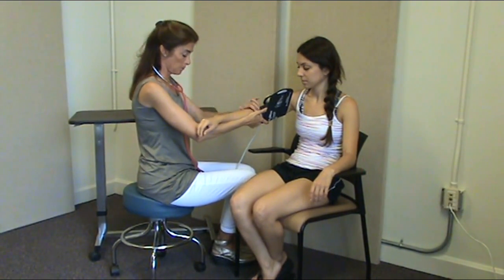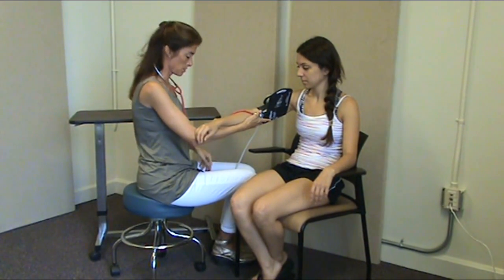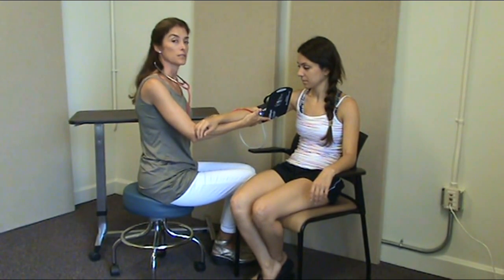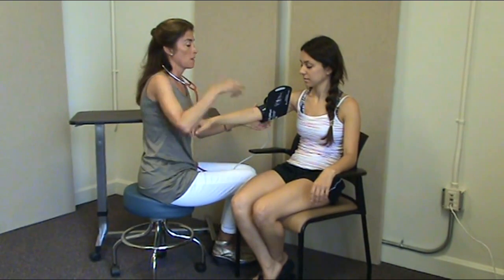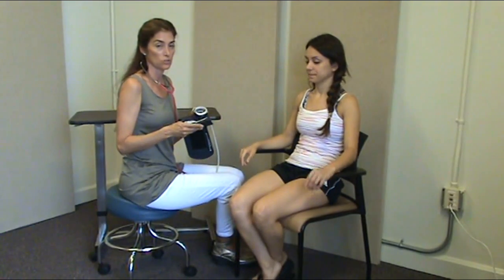Then you'll place the diaphragm of the stethoscope on top of the brachial artery, inflate the blood pressure cuff, and slowly deflate. Make sure you deflate the cuff completely before you remove the cuff. And don't leave a cuff half inflated on the patient's arm. It's very uncomfortable.